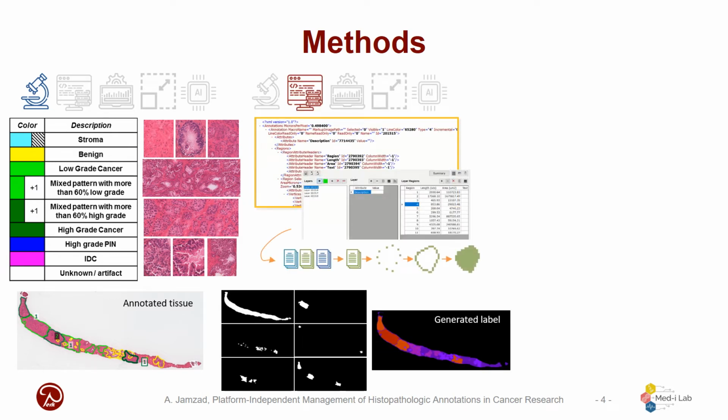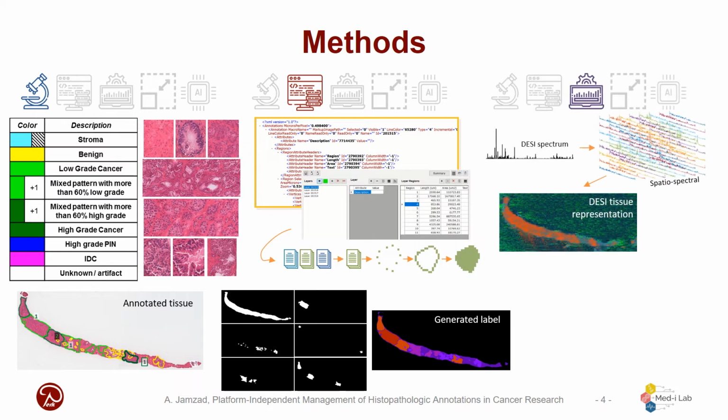Next, the annotation data, which contains boundaries, coordinates, and comments, were exported from the digital platform. Each was post-processed and compiled into a multi-layer label image. The metabolomic profiles of the biopsy cores were then collected and analyzed by DESI.